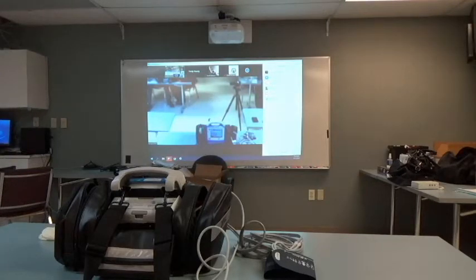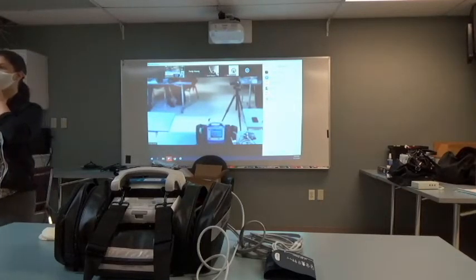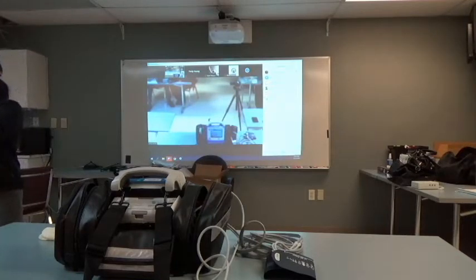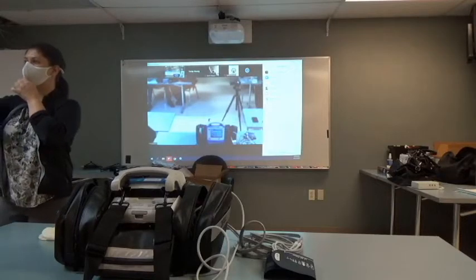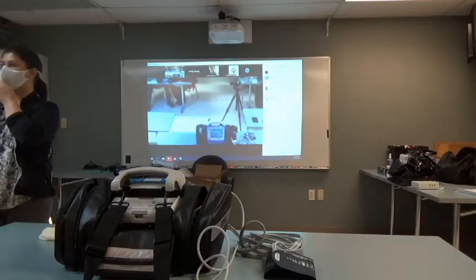What does it do for the blood pressure? Yep, so if the machine is struggling to get a blood pressure, maybe you guys are bouncing down the road and it's trying to distinguish a bump in the road from a beat, it can say, oh, okay, I have the patient on the four lead, I'm going to sync to that R wave and only pay attention to that. Okay, I understand. Does it work with the pulse ox too, like the smart cuff? No, smart cuff only works off of the four lead.